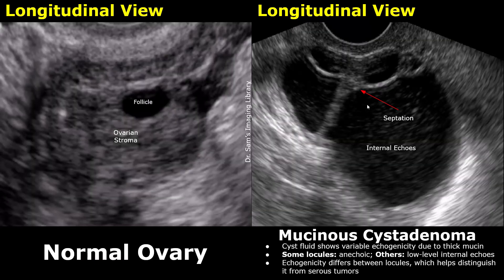Let's look at another case of a mucinous cystadenoma. In this image, we can see 5 locules and we can also see internal echoes within the mass. In a serous cystadenoma, we will not see internal echoes in the mass. This haziness will not be seen in a serous cystadenoma — they will appear completely anechoic.